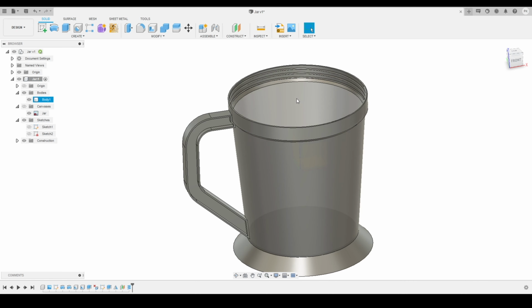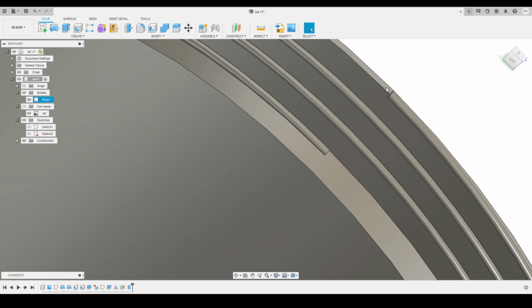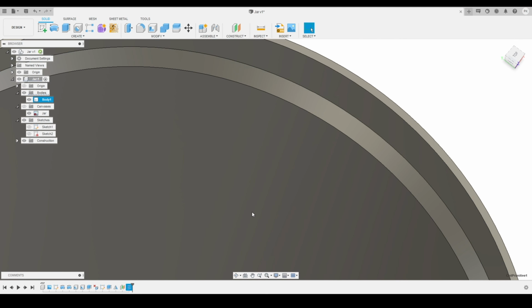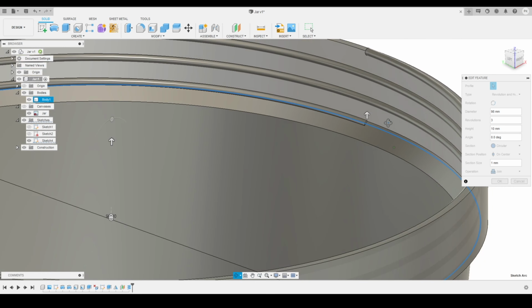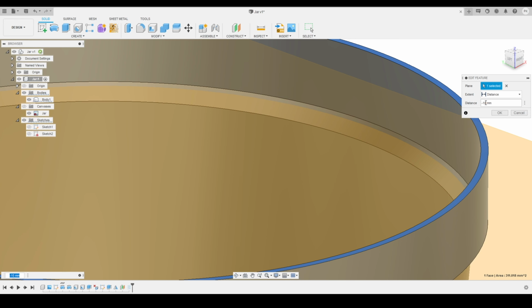Here you can see, so we had just accepted the results, and now I think we had to adjust a few more things. Like here you can see it's just crossing the top face of the coil. So I will just edit the coil again, and I need to adjust the height of the coil. So I just want to make it a little bit lower. So before that, I will adjust this offset plane. Instead of 10 millimeter, I just want to make it 9 millimeter or maybe 9.5 millimeters.